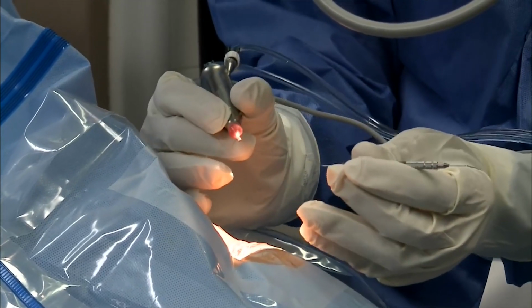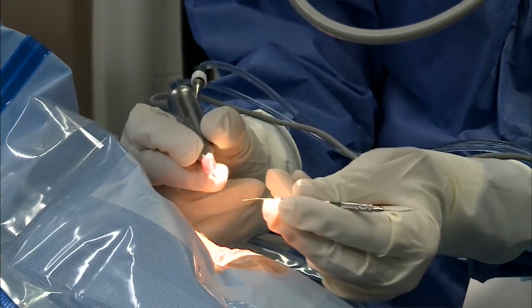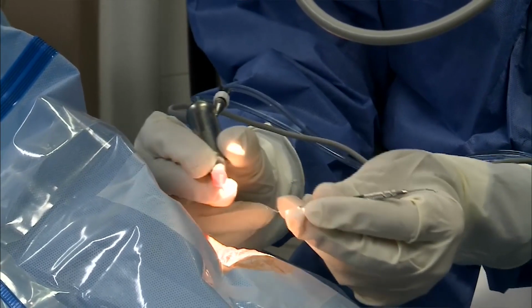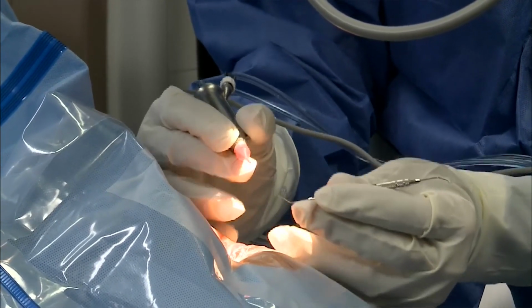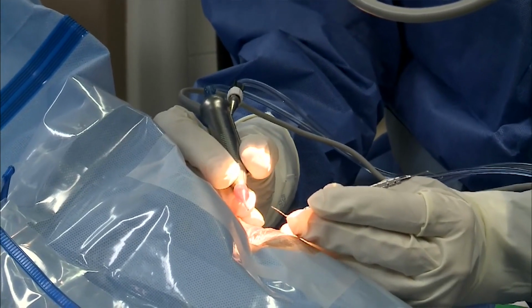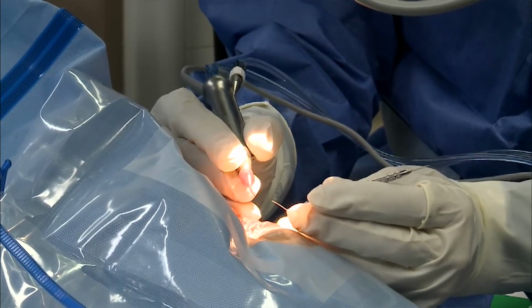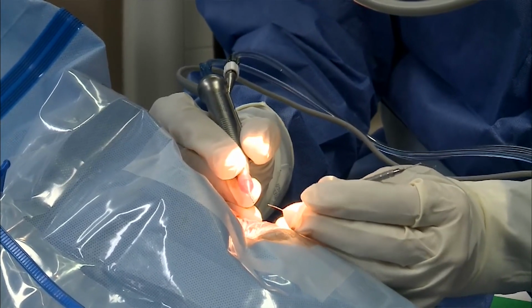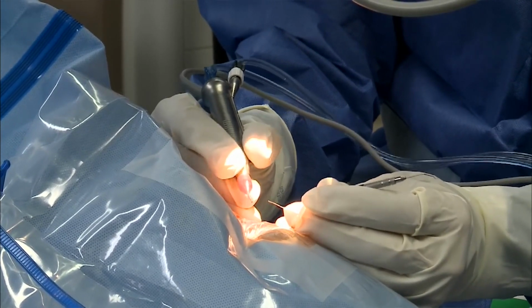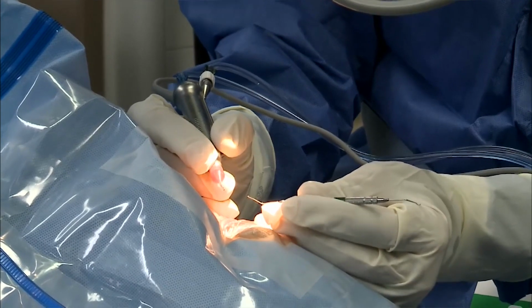And now a little more about stabilization. Typically, you'll use 3 fingers, the thumb and the 2 adjacent fingers, to hold the instruments. The other 2 fingers go down like so. And then, when you lower your hands, you're very stable. These 2 fingers hold it very stable. And the other 3 can do just about anything. Rotate, up, down, and hold the instruments short.